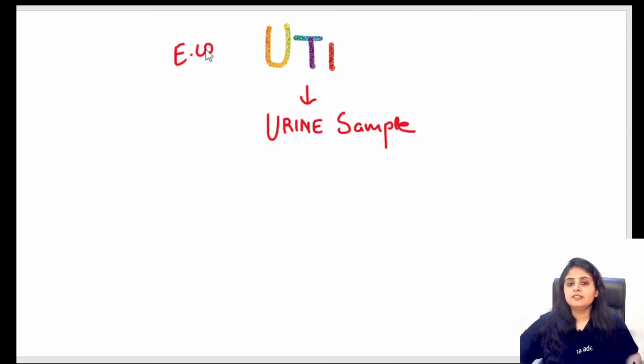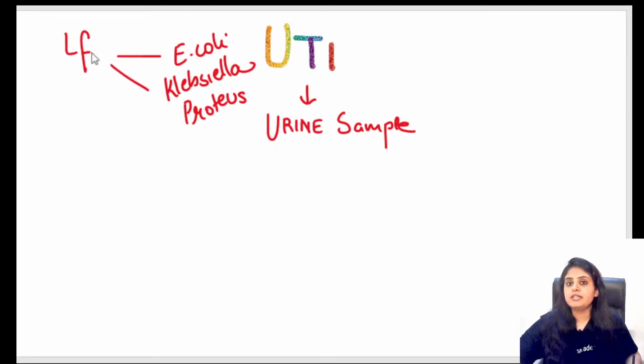You say UTI happens from E. coli. Commonly people think it happens from E. coli, Klebsiella, Proteus. So basically, I am dealing with all members of the same family. E. coli and Klebsiella are lactose fermenters. So I think I will put the urine sample either on a MacConkey agar or on a CLED media. That is when I'll be using them.